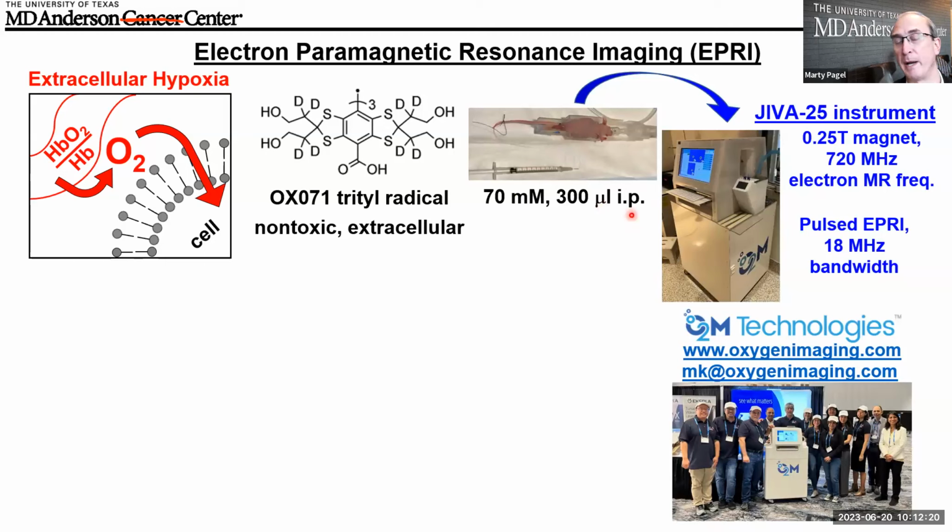We administer intraperitoneally, so the agent lasts a while in the mouse, and you'll see in the experimental design in a moment, that's about 90 minutes. So I have to do an IP injection, but intravenous certainly works fine, and others have done that too. By the way, we're injecting at standard concentrations that are equivalent to what a standard MRI contrast agent would be, gadolinium-based, Dotarem or Magnevist, that's injected in mice or in patients. So no, you don't need a much higher load, but it is equivalent to MRI in that regard.